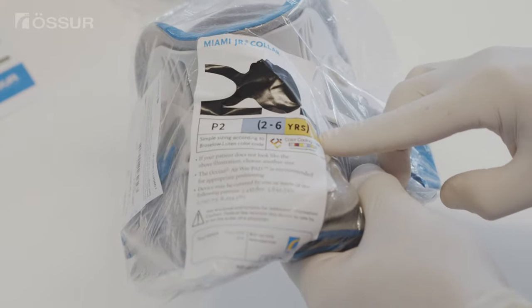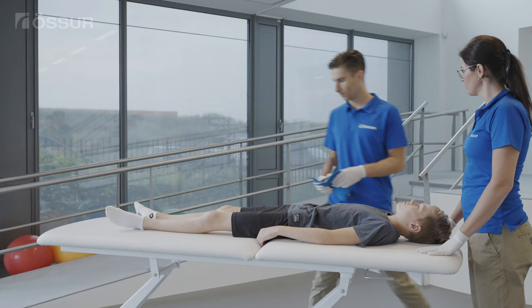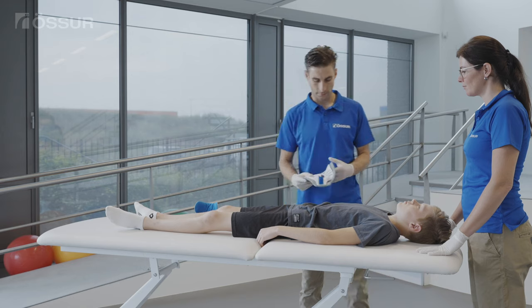Ensure that correct spinal protocol is followed throughout the application. Position the patient with arms to the side, shoulders down, and head centrally aligned.